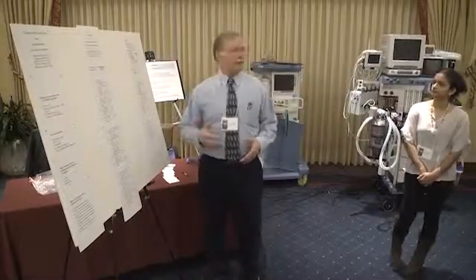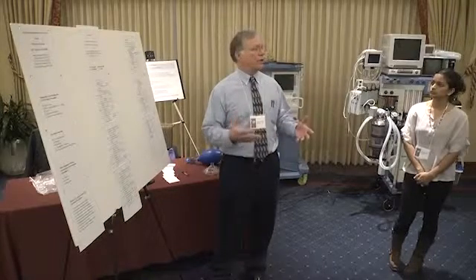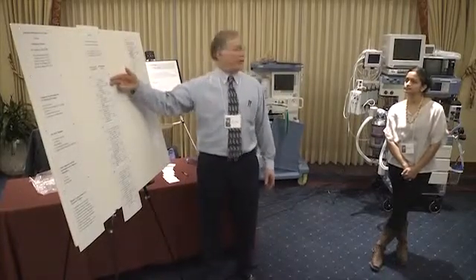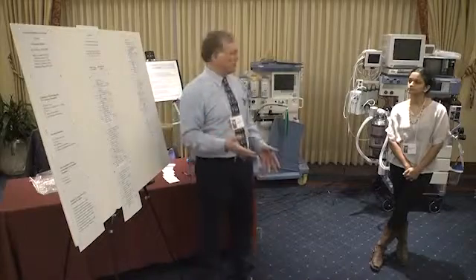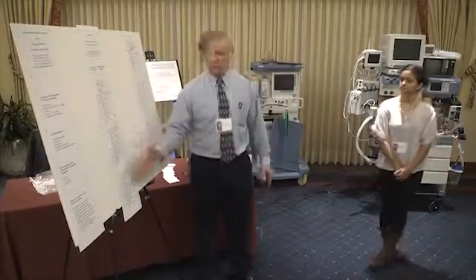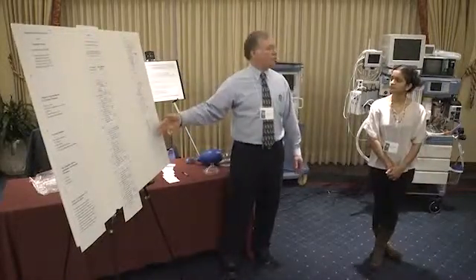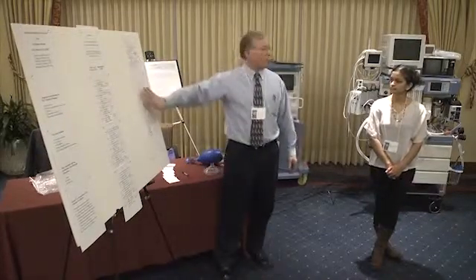From that, in 2008, they designed a set of guidelines of what you want to check on your machine. A large panel sat down and said, what should we really check in our machine? What should we throw out? What should we keep? And they developed this list of things. You can see on the side here they list provider and tech. So if you have an anesthesia tech, these are steps they can do. Some will say provider or tech, so you can designate some steps to an anesthesia tech if you want to, but there are steps that you should be doing. And what we were talking about, an in-between machine check, that's what this is over here. If you're doing an in-between check, you don't have to do all these steps. You can just sub-step from that.